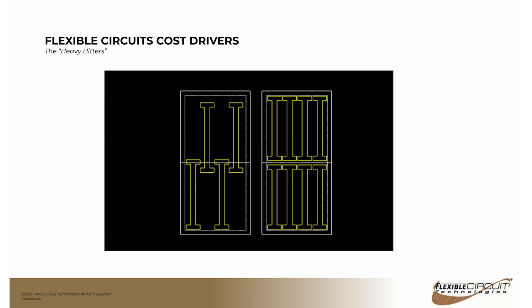So reducing the part size by 3/8 of an inch could literally cut the cost of the circuit in half. So it's always important to keep in mind how you're using your panels. Fortunately for catheter users, those are typically long and straight, and they usually do panelize pretty well. But I have seen some where they'll put a right angle, like a flag on one end or the other, and that can really cause a problem with panelizing. So it's important to try and make the parts so that they panelize as well as possible.